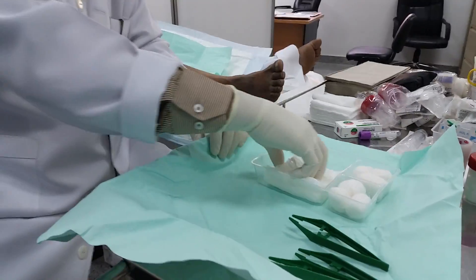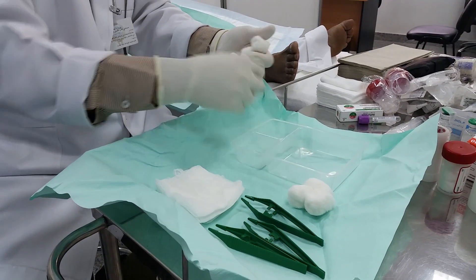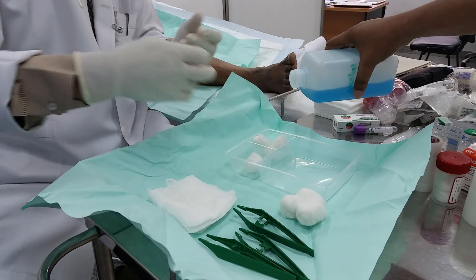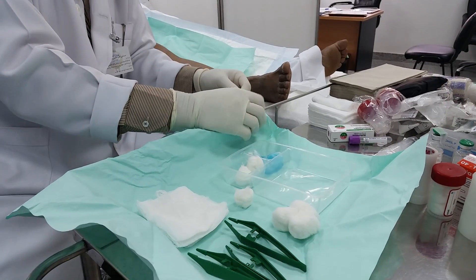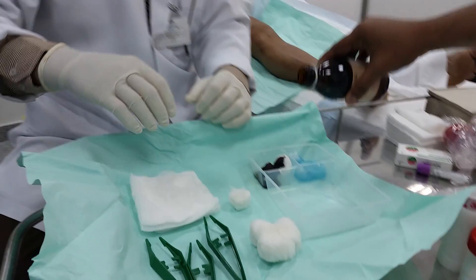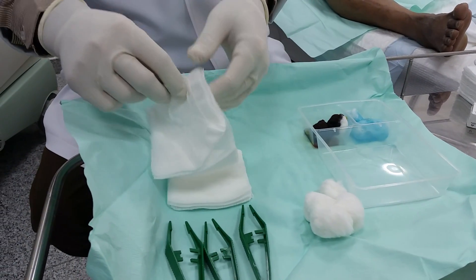I will arrange my items first so the setup will be clear and I will not struggle with my tools during the process of aspiration and injection. I will make designated places for waste and for use. I will keep this area to put my needles for aspiration and injection. We are planning to do aspiration, so we will have sterile bottles for collection of the synovial fluid.